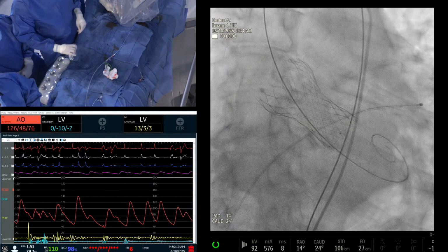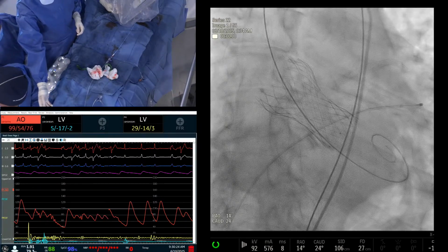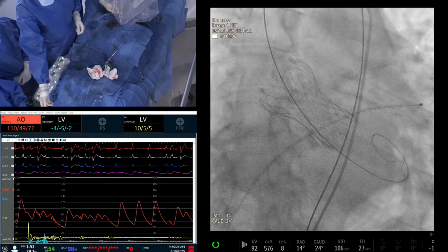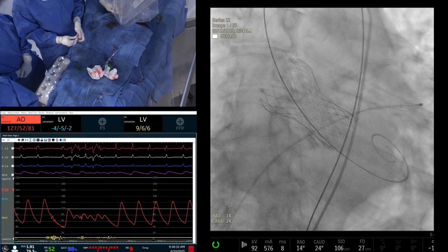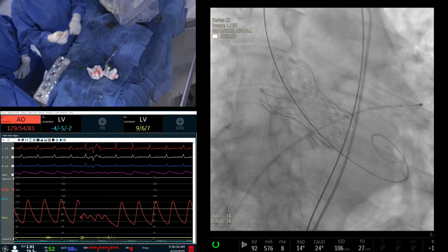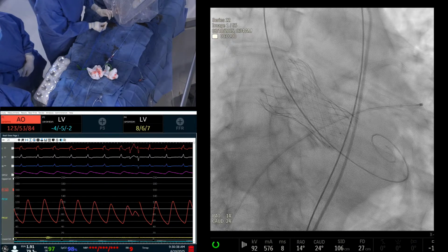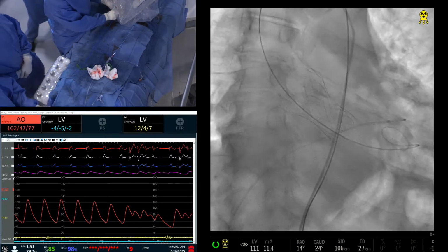And as you know, with all that trial data coming in for cerebral embolic protection, the whole enthusiasm for CEP has gone down, and our number also has gone down. At peak time, we used to be 58%. A few months ago, we became like 25%. I don't think we are 25 now, even much lower. 10% maybe. Maybe not even 10.